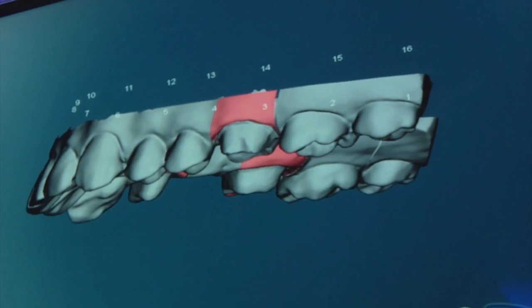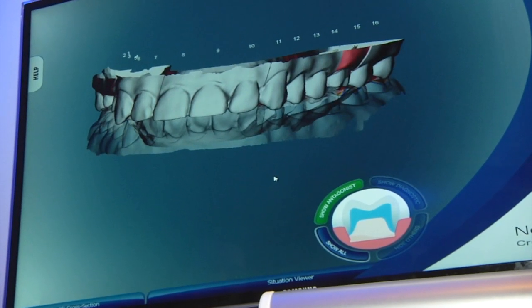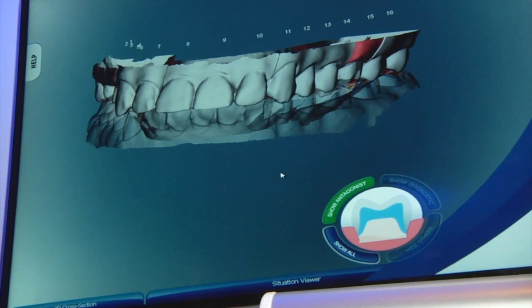In addition to solid model scanning, we've also been able to introduce actual antagonist model scanning — again, another feature that the 1G is not able to support.